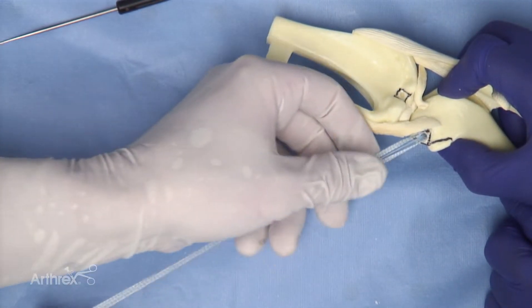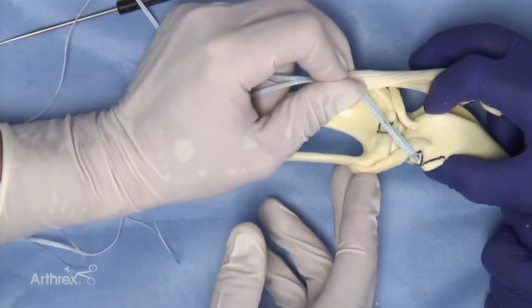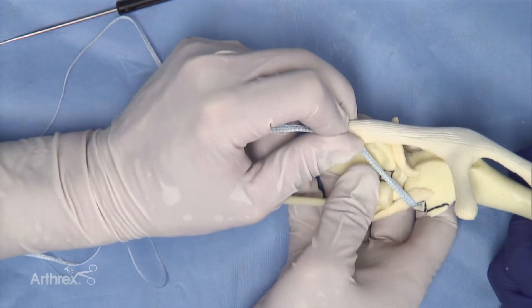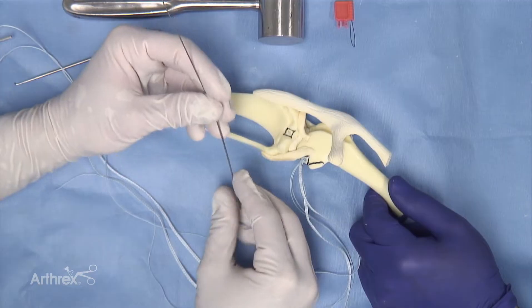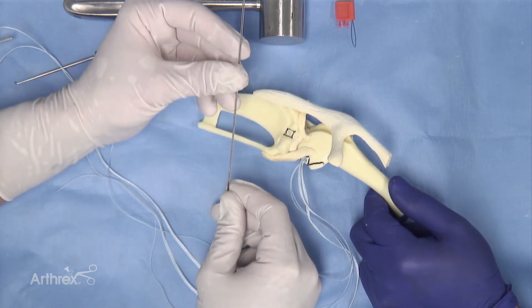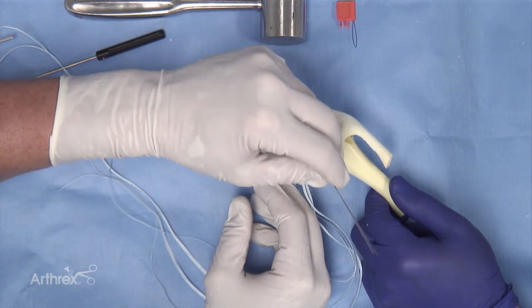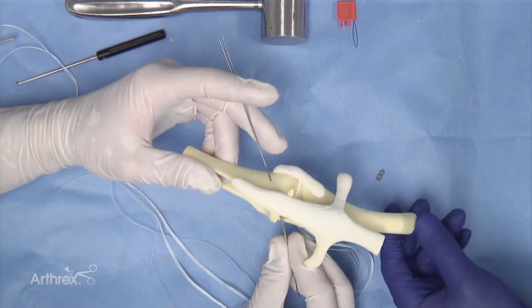We now have two strands of material: the two millimeter fiber tape and the fiber wire. These implant materials can then be placed across the lateral collateral ligament and through the tibial tunnel. To perform the tibial tunnel insertion we use two eight inch nitinol loops, placed simultaneously through the tibial tunnel from the lateral to the medial aspect.